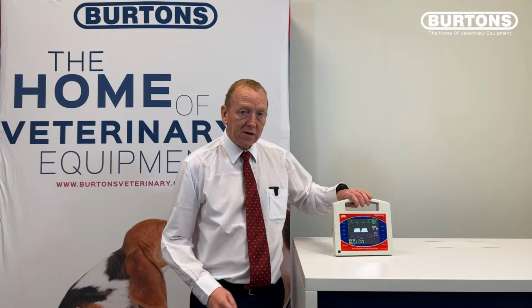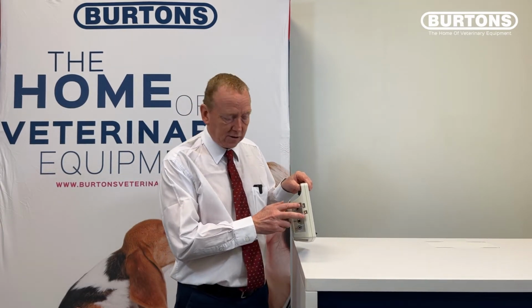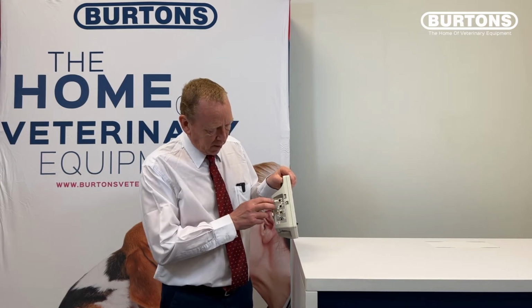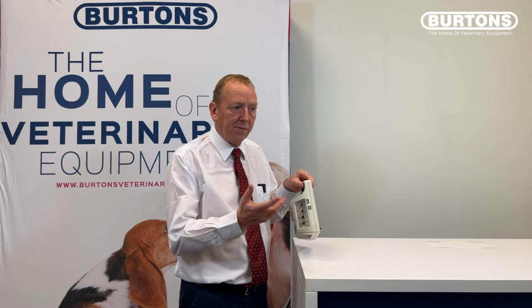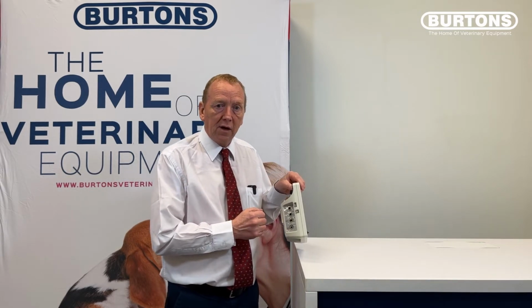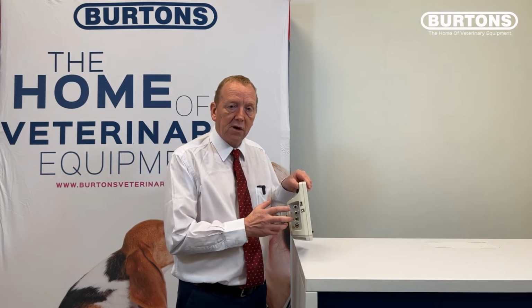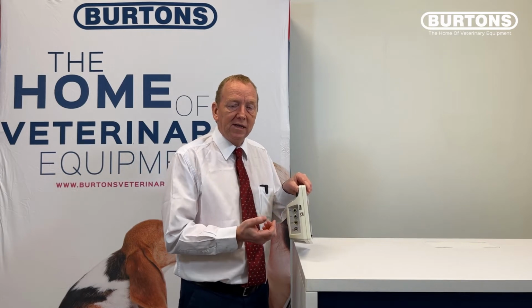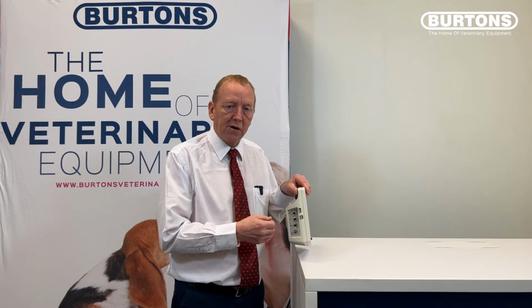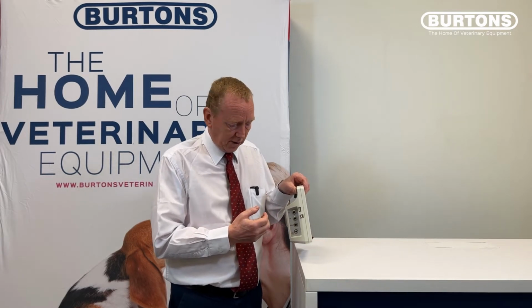On the other side of the monitor we have another four connections and a couple of USB connections. To start with, on this side, we have two temperature connections for dual temperature measurement, so we can have an external or an internal temperature probe. We have an ECG connection, and our ECG modules are either single channel or six channel, that is single lead or six leads: lead two for a single channel, or three leads plus the augmented leads for the six channel. And all of those channels are diagnostic quality.